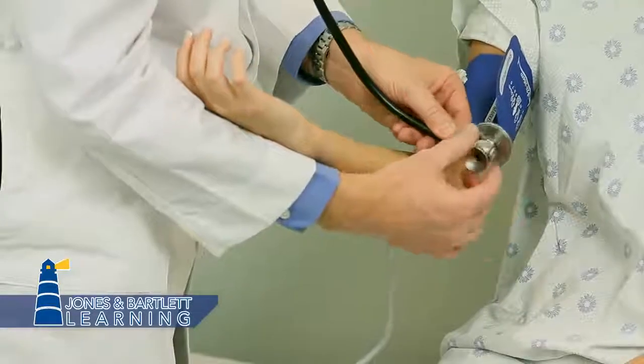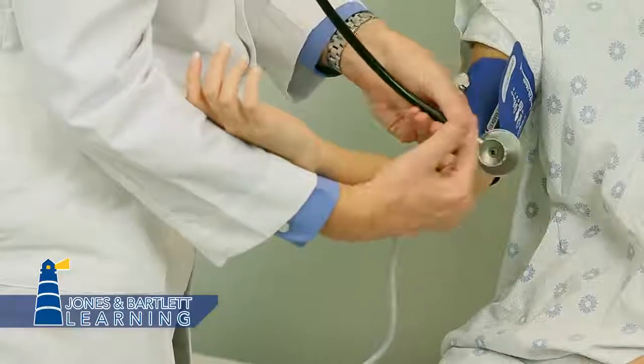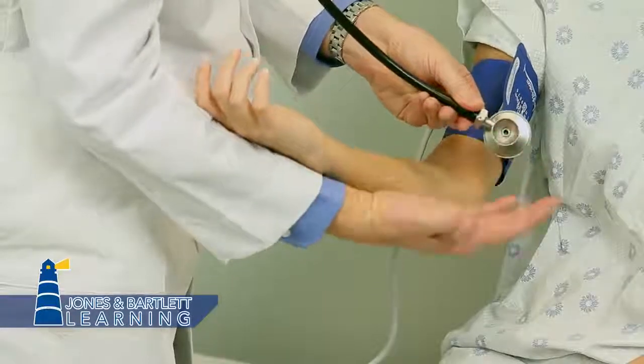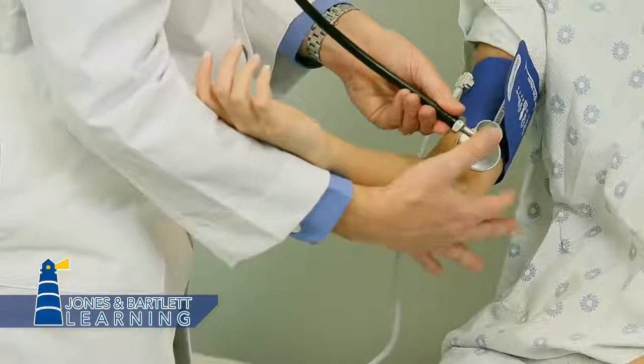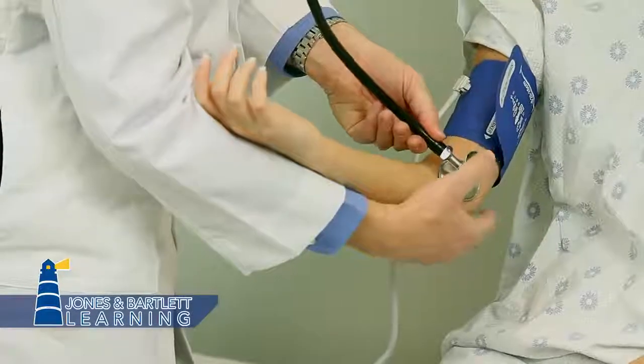Some stethoscopes used to be non-tunable, which means that you could hear out both sides. Most stethoscopes made today, this side is open. I can hear on this side, but if I tap that side, there's no sound there. So now I can put my thumb on top. Otherwise, you used to have to put your hands on each side instead of on the back. This one I can put on the back.